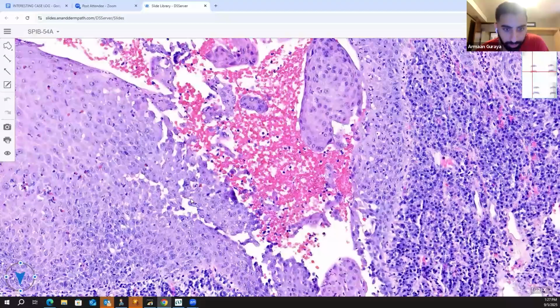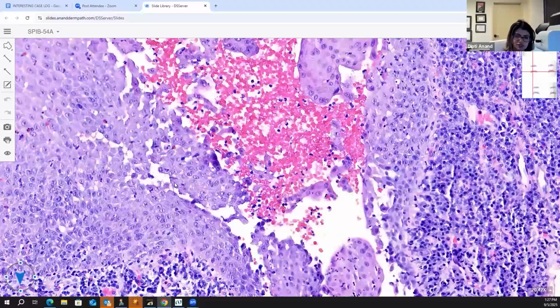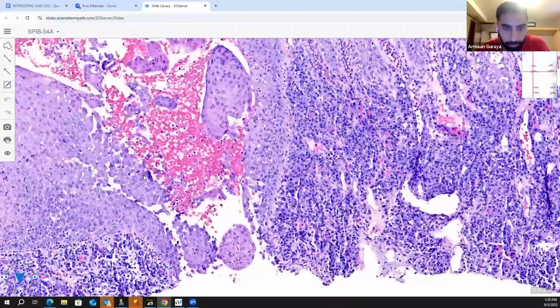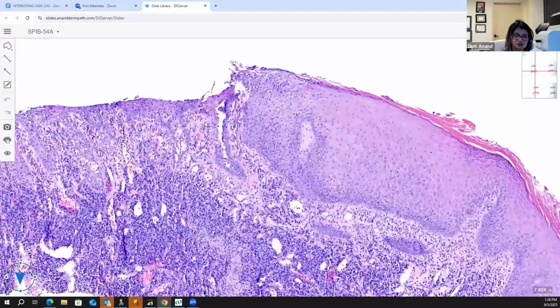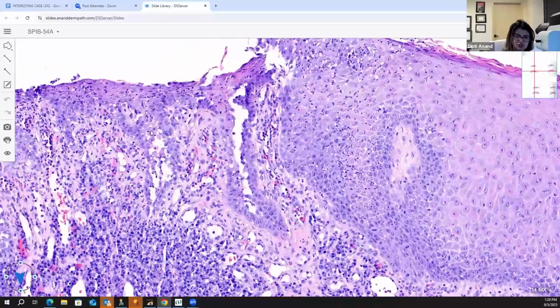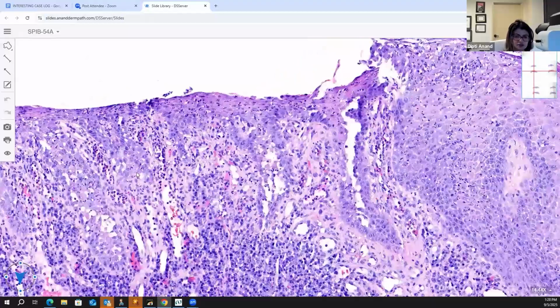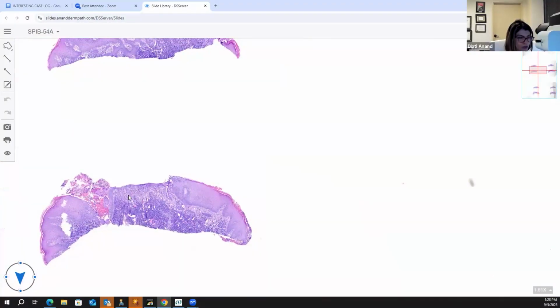It's like dilated blood vessels. This is the epi. What are the cells doing in here? Falling apart. They are falling apart. It's acantholysis, right? You see here on the top, this is the denuded epidermis, but at the base there is suprabasilar acantholysis. So put all these together: a thick epi, eosinophilic microabscesses, plasma cells because of the location, suprabasilar acantholysis.